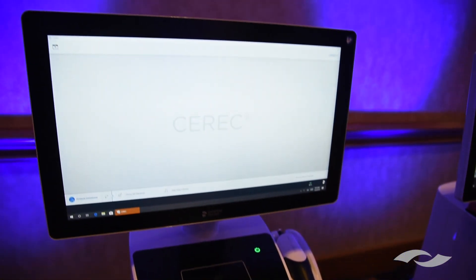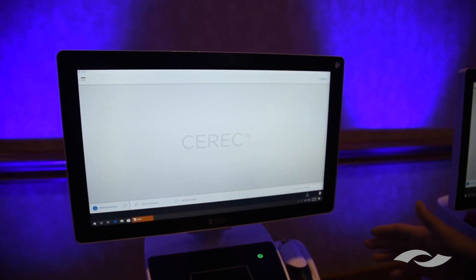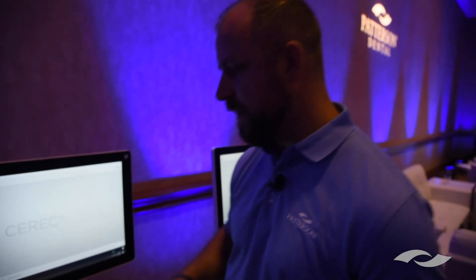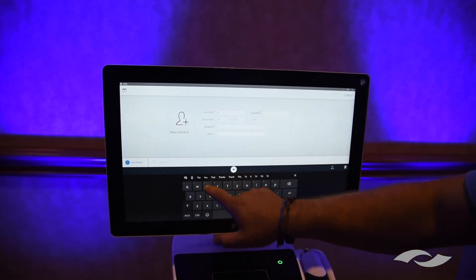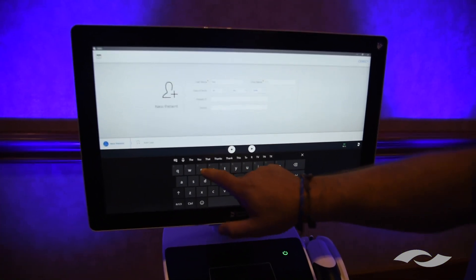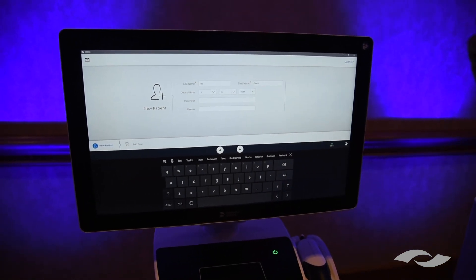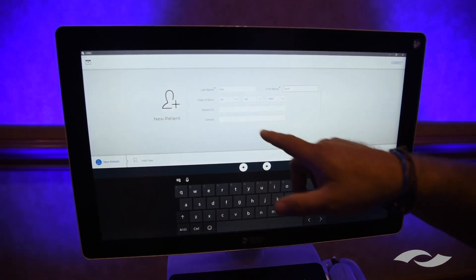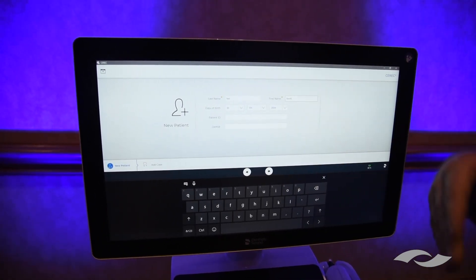This is the CEREC 5.0 software. It's laid out to be very user friendly to lessen the learning curve — pretty much anybody can jump on here and figure it out. You only have two options: add a new patient or show all patients. Adding a new patient asks for basic demographics: last name, first name, date of birth. You can also add a dentist name, so if you're in an office with more than one dentist, you can track production by dentist and pull up how many cases each dentist did.